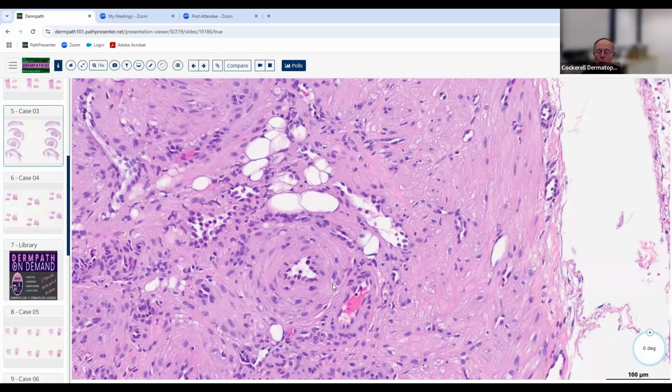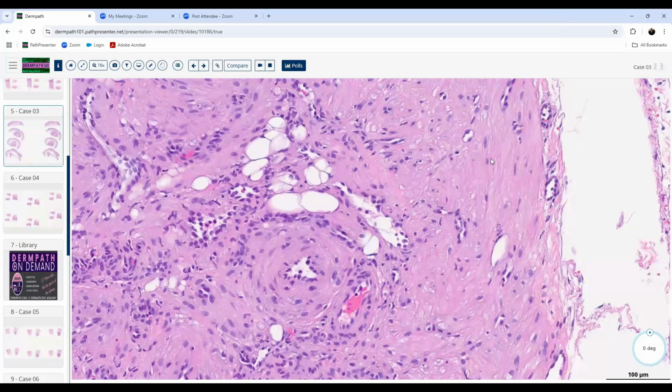And then what's the other place where there's smooth muscle? That we're looking at right here. Around the vessels, blood vessels. Yeah, blood vessels contract and restrict, so you can get smooth muscle cells, myofibroblast and smooth muscle, involving blood vessels. So we've got these spindle cells with blunt cigar-shaped nuclei that don't look like lazy S's swimming in a sea of fibromucinous stroma, with this pink cytoplasm here, and then we've got this blood vessel. So what kind of smooth muscle do you think we're looking at here? More of the second kind, surrounding the blood vessel.